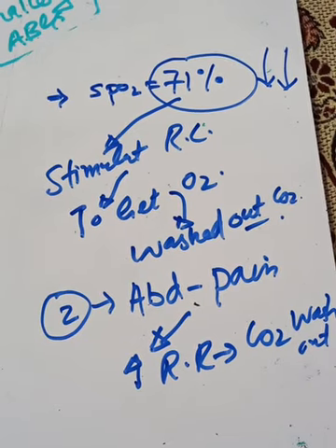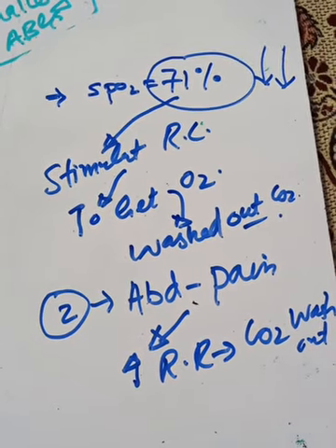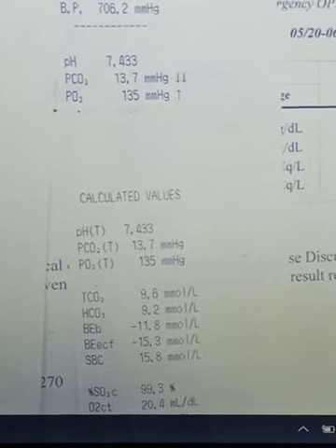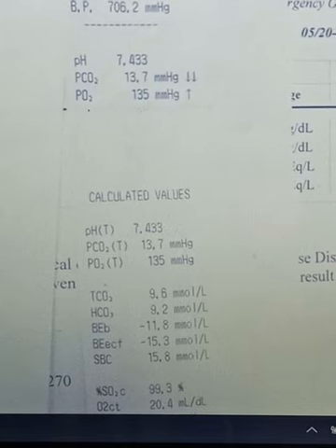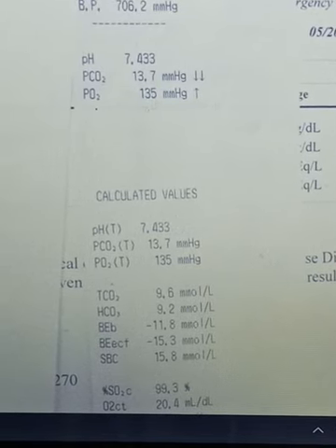Now let's move toward the ABGs which were done on the second day of admission. These were the ABGs done on the second day, and this patient was started on IV antibiotics.